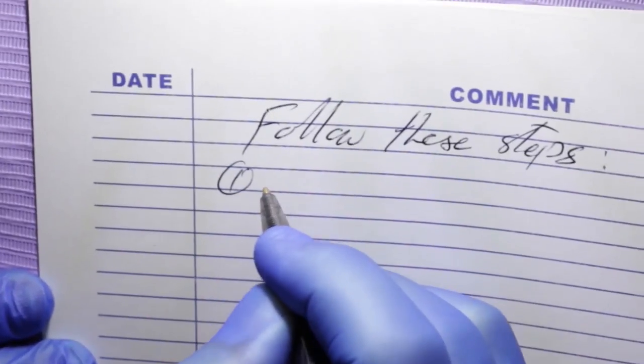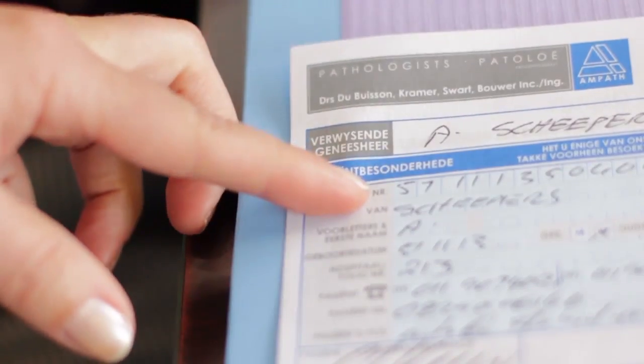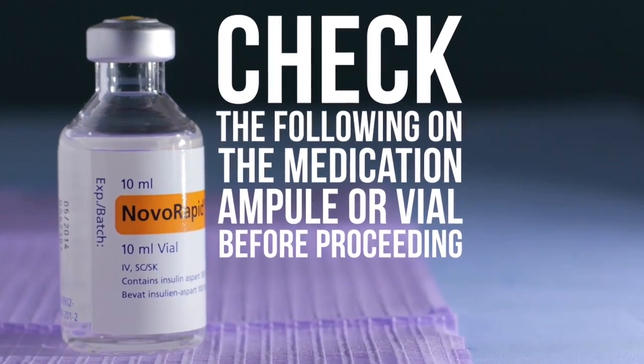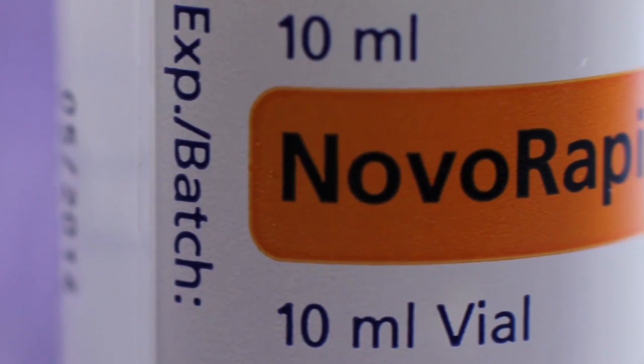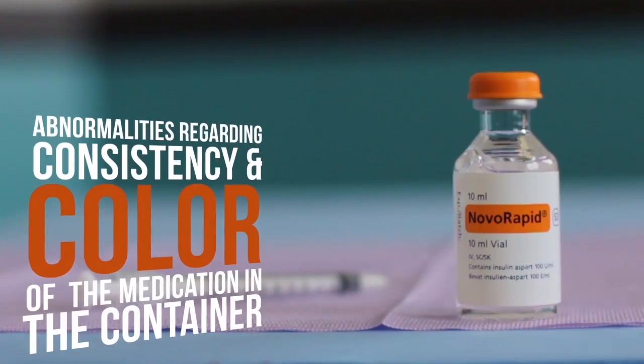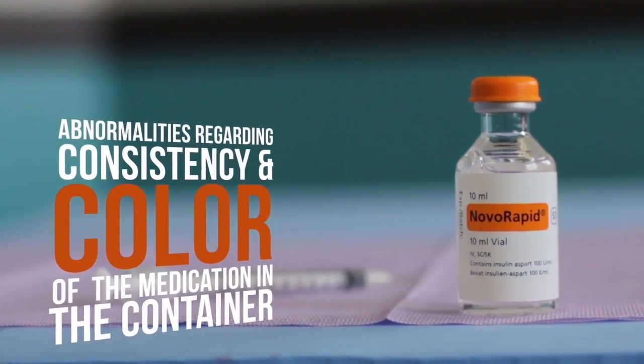Follow these steps. Greet the patient and positively check the identity of the patient. Check the following on the medication ampoule or vial before proceeding: the correct medication name, volume, and concentration; the expiration date of the medication; and any abnormalities regarding consistency and color of the medication in the container.